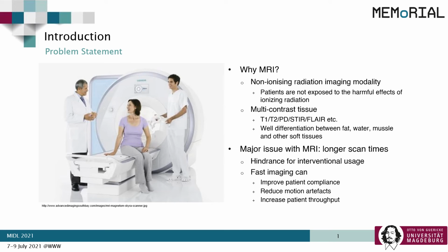One big drawback of MRI is the long scan time, making it difficult to be used during interventions. Reducing the scan time can not only help in the interventional usage, but can also improve patient compliance, reduce motion artifacts, and increase patient throughput.